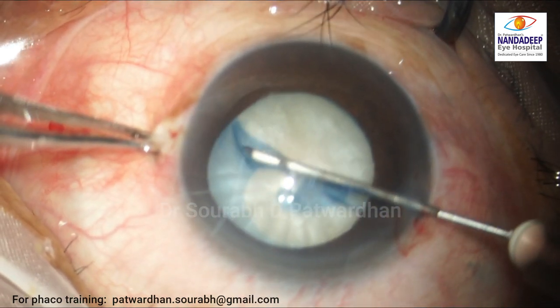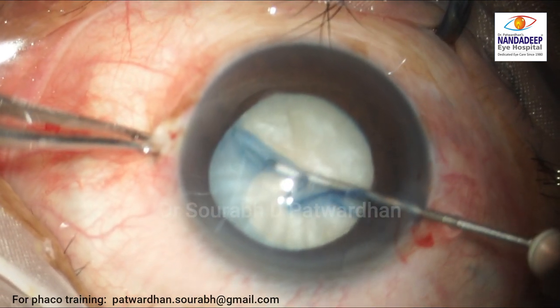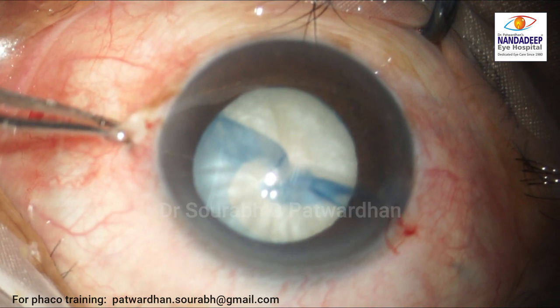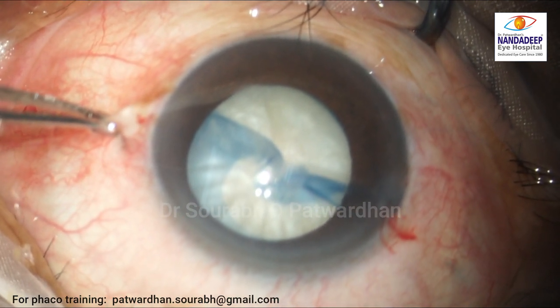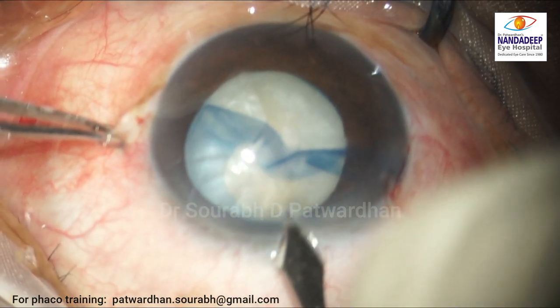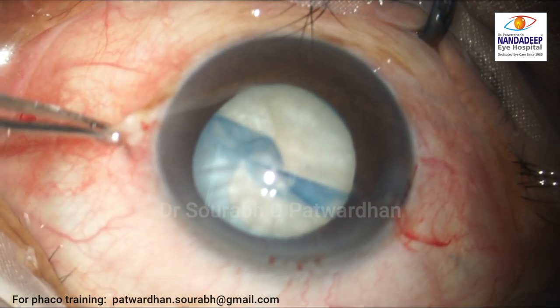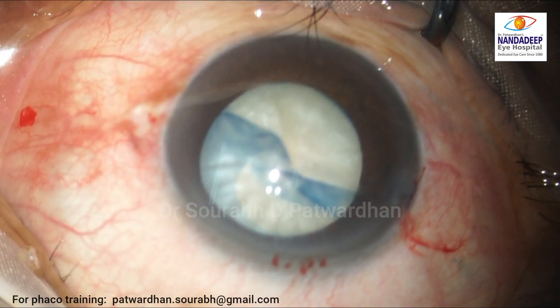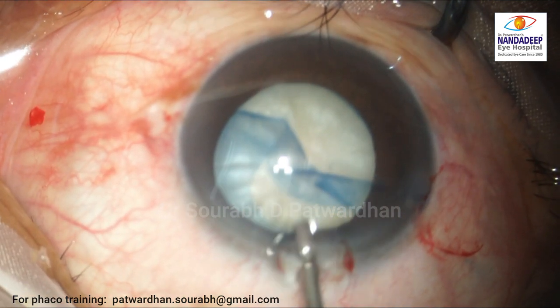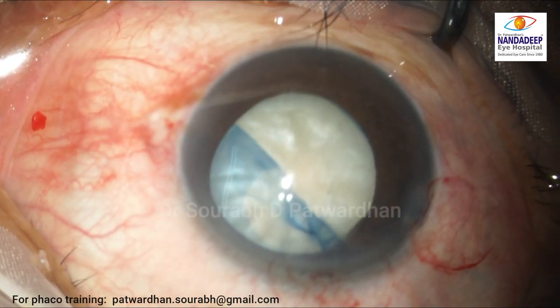The surgeon tries to pull it back and momentarily considers doing a little's manual, but decides on another technique. The surgeon decides to make the main incision here. The surgeon might be thinking of using forceps to bring the rhexis in, which is a good approach because forceps give control over the pull, particularly in such situations.